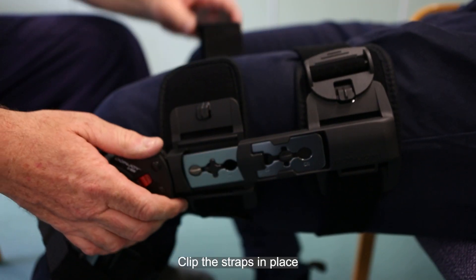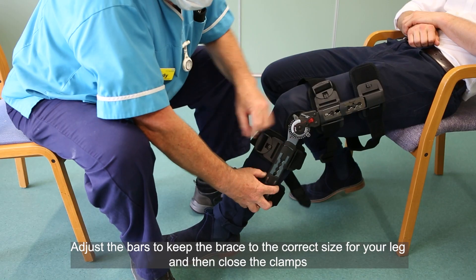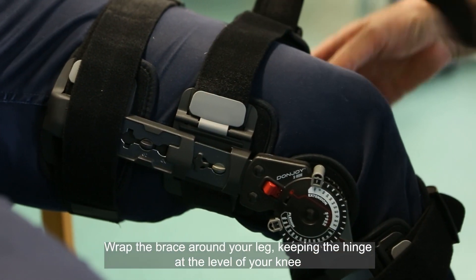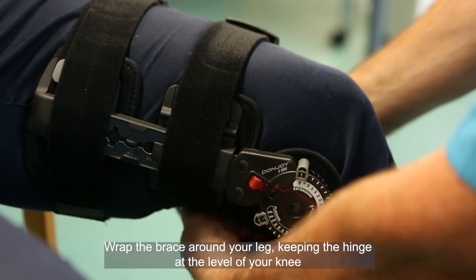Clip the straps in place. Adjust the bars to keep the brace to the correct size for your leg and then close the clamps. Wrap the brace around your leg, keeping the hinge at the level of your knee.